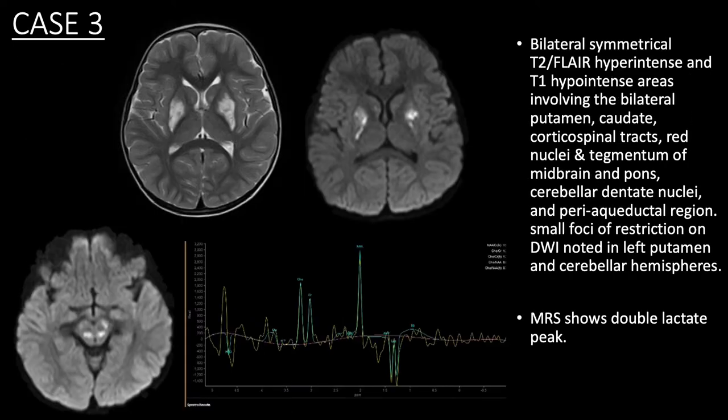In our third case of a 4-year-old male patient, T2 FLAIR hyperintensities are seen in bilateral putamen, caudate, tegmentum and periaqueductal region, which shows diffusion restriction and double lactate peak on MRS.